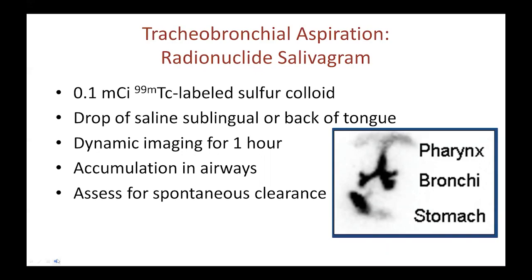And it's also important to assess for spontaneous clearance, as it does provide some prognostic information. Here we can see tracer in the mouth as the patient turns their head back side to side, passage into the stomach, and unfortunately in this patient, accumulation of tracer within the airways.